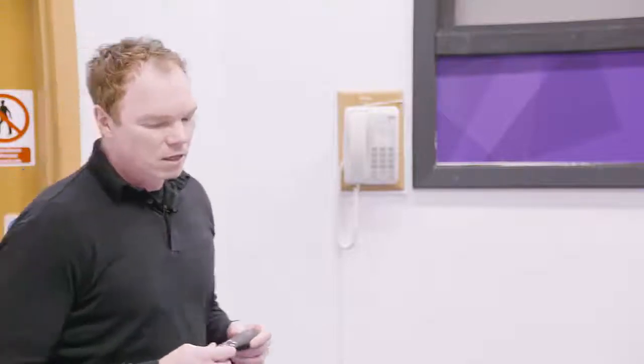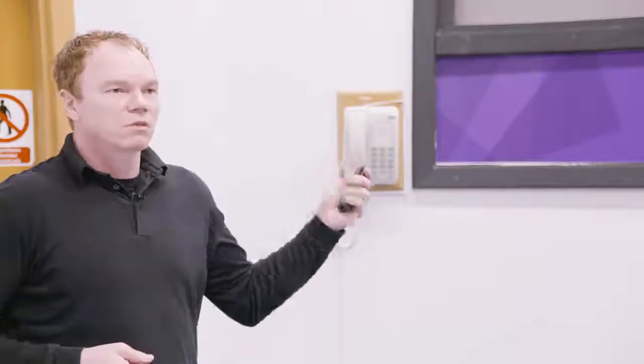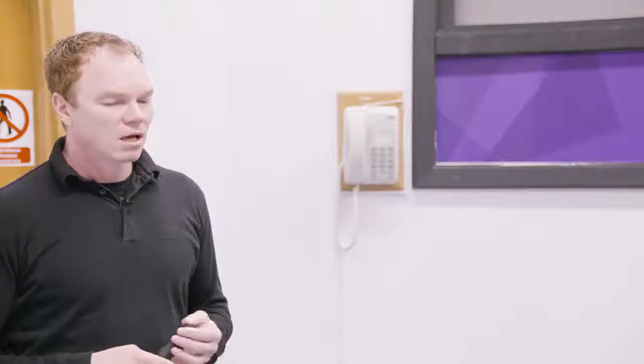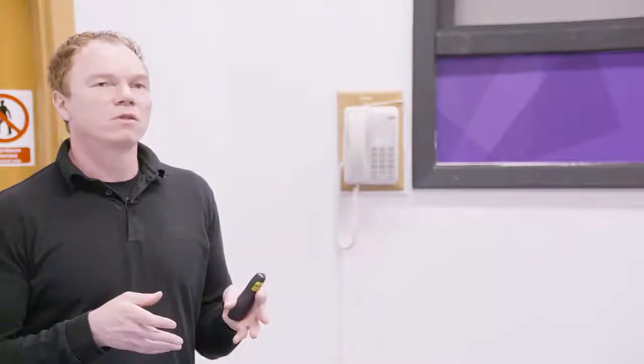Okay, now we'll talk about reference values that I was mentioning before. When you do the measurement and get these numbers that I was just showing, if you cannot compare them to some other numbers, they don't mean much.